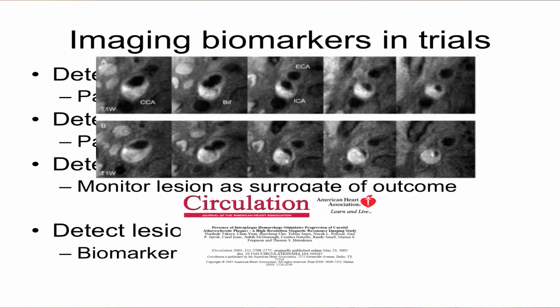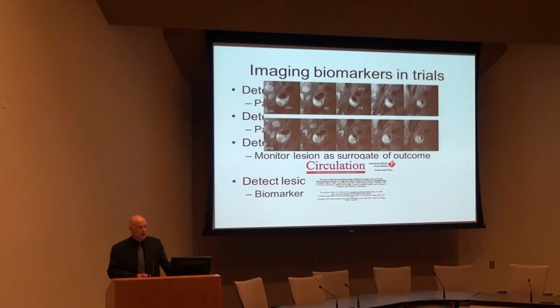And finally, using MRI as a measuring tool, an expensive one, but an accurate one, whereby we can image a patient at time point 1 on the top images, ask them to come back a year later, use MRI to measure volumes, lumen areas, etc. This work by Chunyuan in Washington showed nicely that MRI is a very good tool at measuring progression of atherosclerotic disease in the carotid.